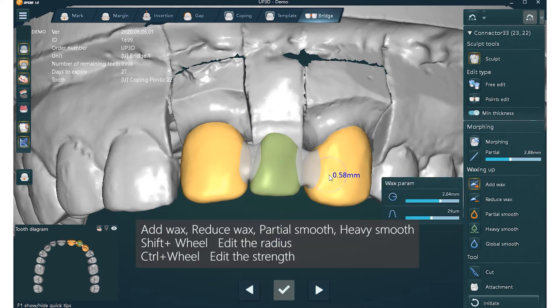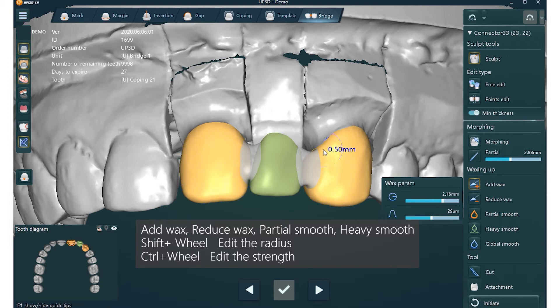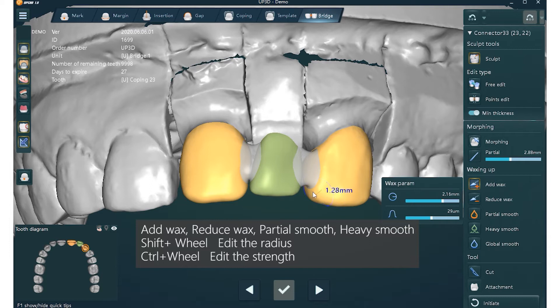Add wax. Reduce wax. Partial smooth. Heavy smooth. Use Shift and wheel to edit radius. Use Ctrl and wheel to edit strength.